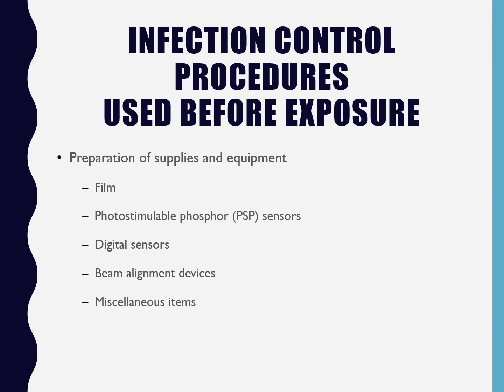You're not going to start taking radiographs and then be like, oh yeah, I need to go get this item. That's not how you do it, because then you have to completely undo all of your stuff in order to be clean, and then go get it and then come back and then put all that stuff back on. That's a waste of time. It's a waste of items. It's also going to potentially spread infection. And then the other thing is that having everything ready for your patient ahead of time is going to save you and them time. And we want to make this as smooth a process as we possibly can.